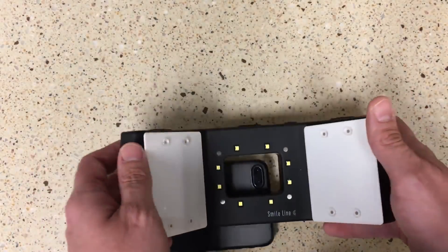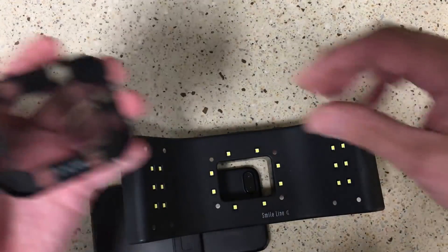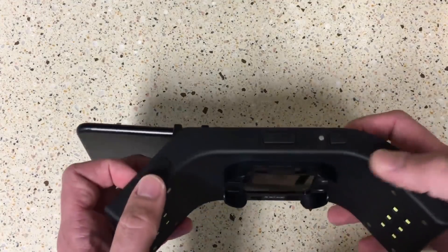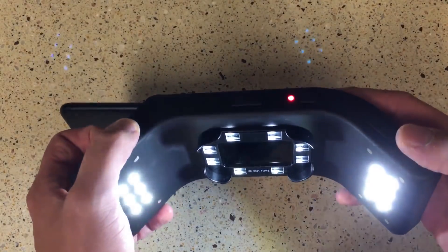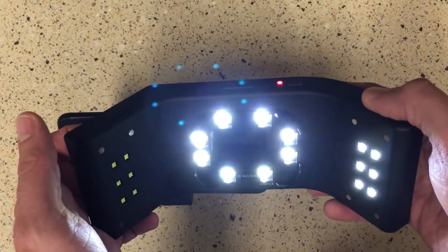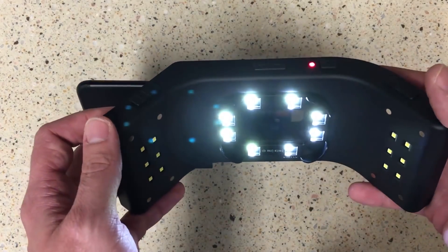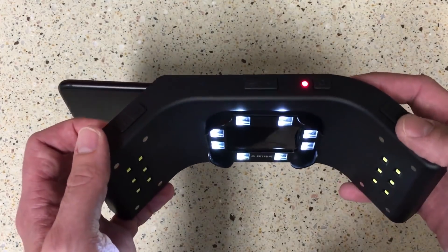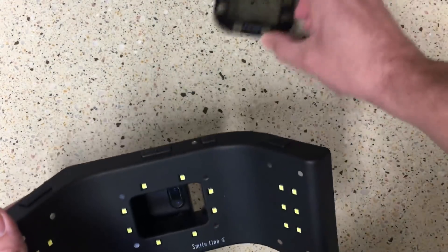It also comes with a polarizing filter that goes on the central portion, and what this does is take away all the glare. You might use this for a single central or something like that — just make sure you turn off the lateral segments when you do this central polarized shot. This is going to give you a really nice shot to send to your laboratory. It's all magnetic, so you just pop it off and you're back to normal.